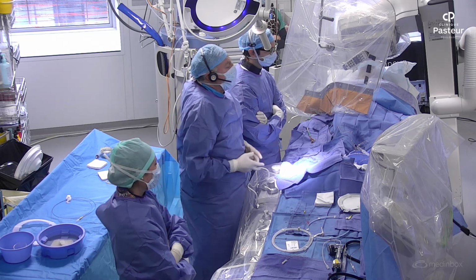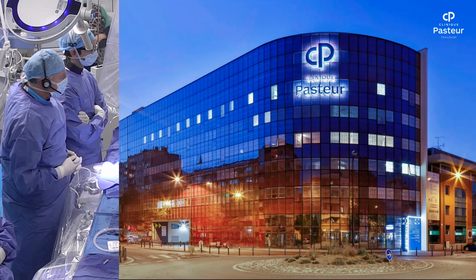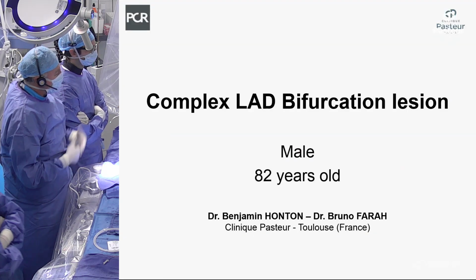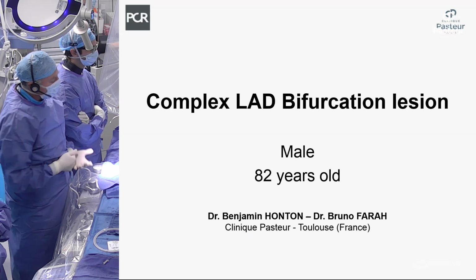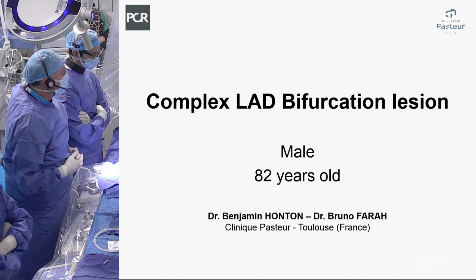So maybe we can now move and present the case. May I have the first slide? So we will deal with a complex LAD bifurcation lesion, but in an octogenarian patient, but you will see that this patient has other problems.